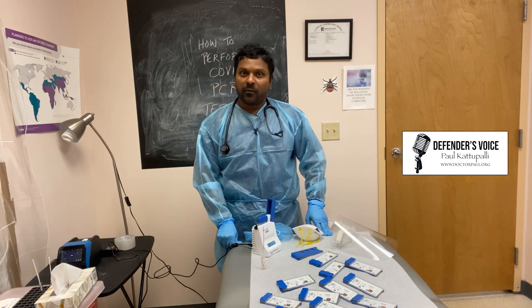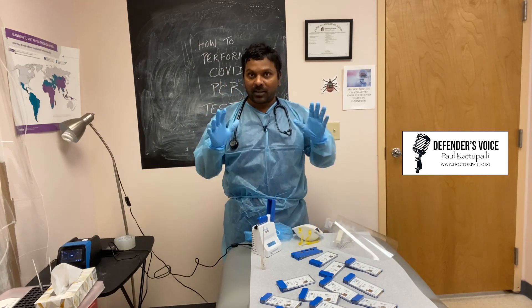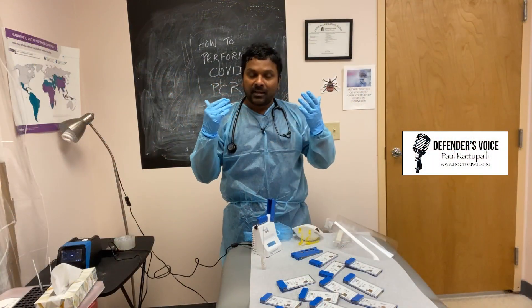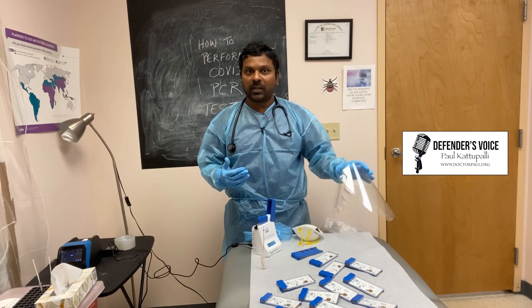First of all, before you perform this test, dress up well because you are dealing with a very dangerous virus. Wear a gown, a face mask, a face cover, and even a face shield would help.